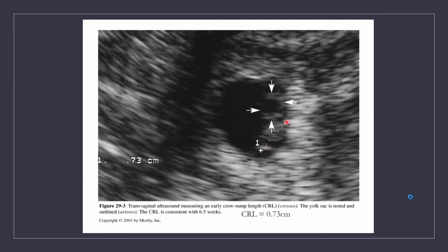Remember, it's the crown to rump length. And so if we look here, it tells us that the measurement is 0.73 centimeters. Now remember, if we add that 6, we have 6.73, and that tells us that they're between 6 and 7 weeks along, okay? And it also says right here that's consistent with a 6.5 week gestation.